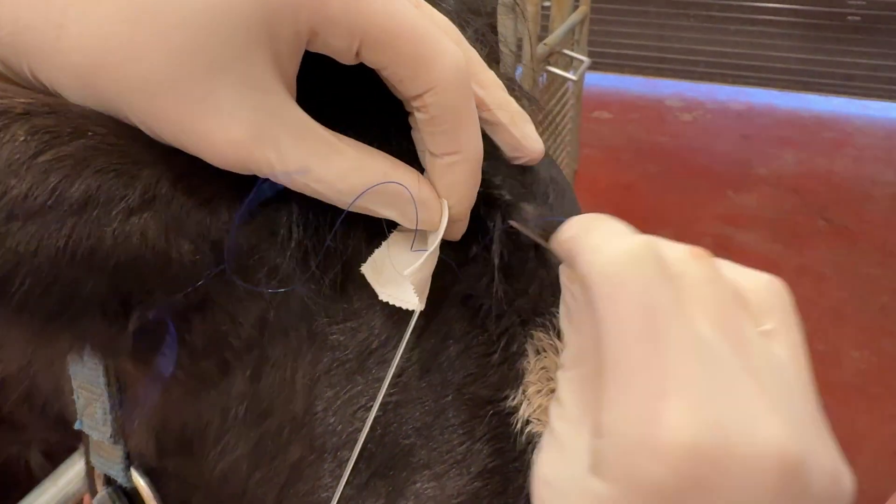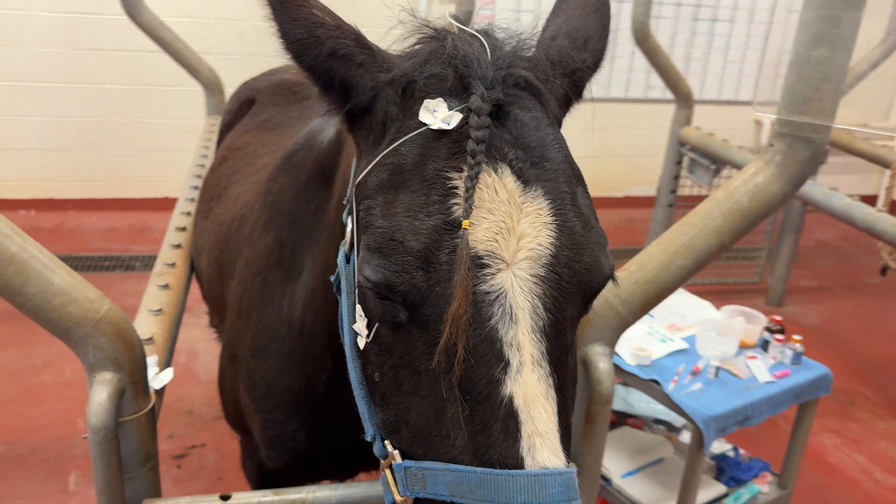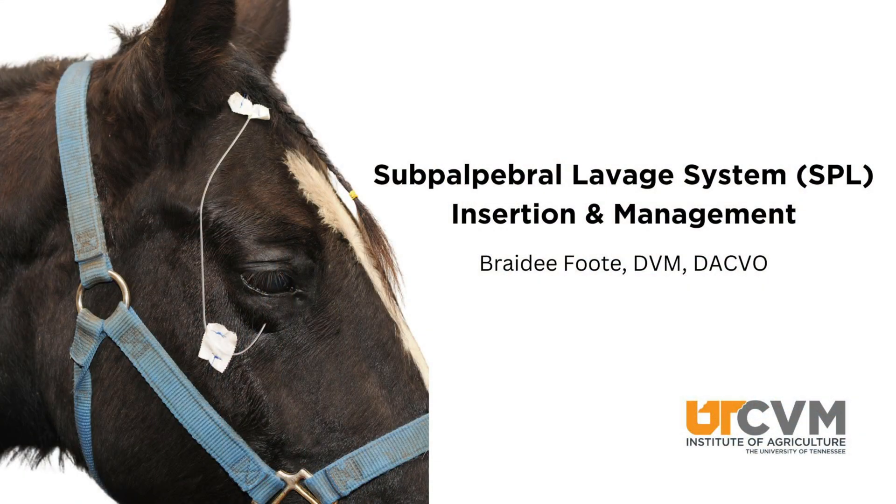And this completes how to place the lavage line. You can watch our other videos in order to learn how to medicate through the lavage line and the different ways that you can place medications into the lavage line.